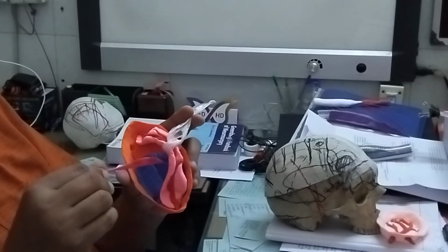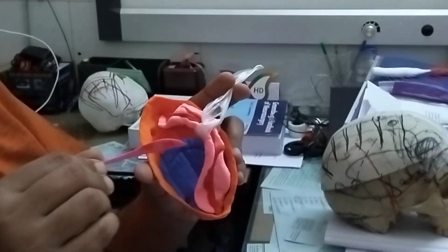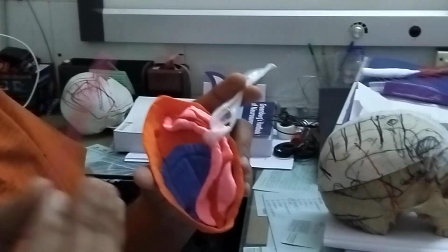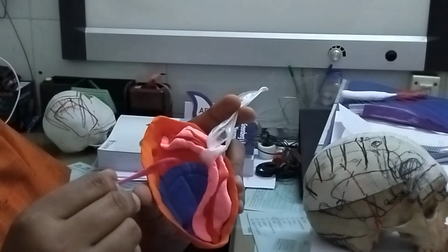see this is the temporalis muscle covered by temporal fascia, and we keep a collar of temporalis muscle in the upper part for better closure of bones.